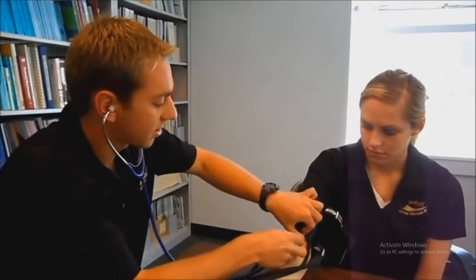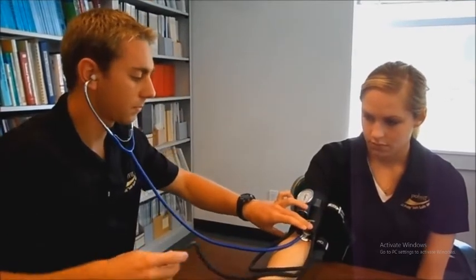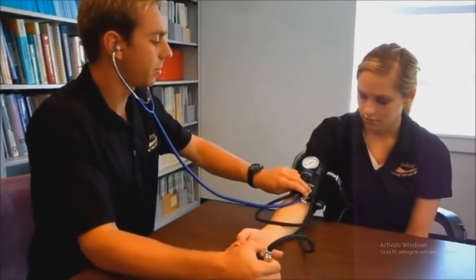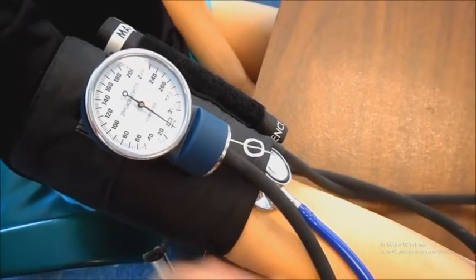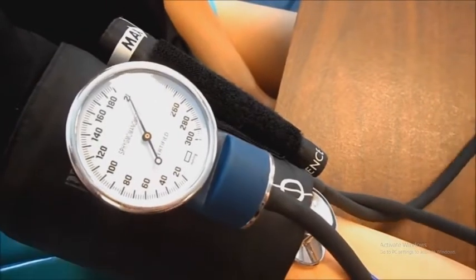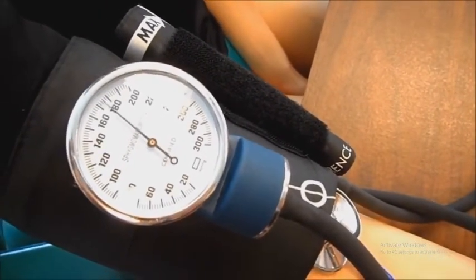So you put these in and put the head of the stethoscope right where you had that pulse. And double check to make sure this is all the way tight. And you're going to squeeze, and by doing this, you pump air into the cuff. I'm going to pump it up again just so you can see in the camera what's going on. So we have it up to about 200, and then we slowly let some air out.